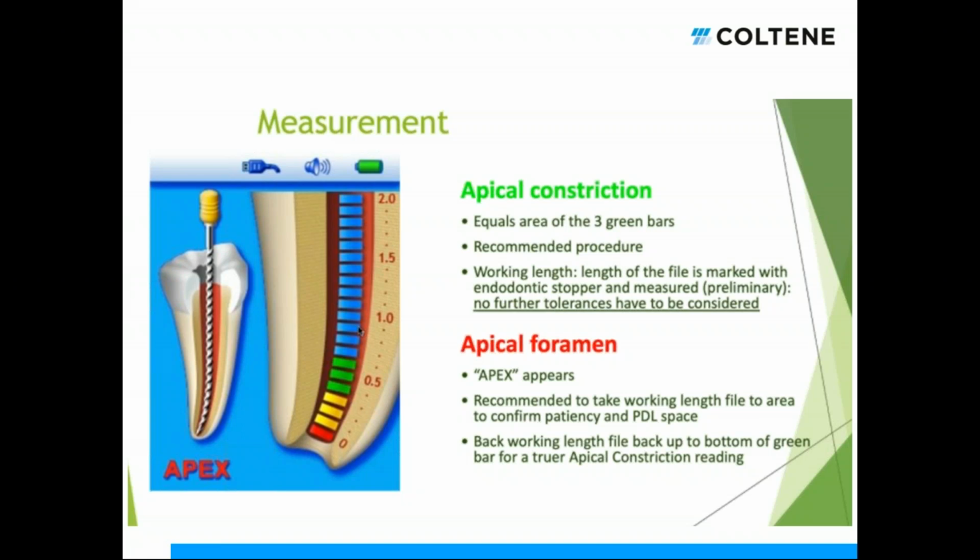Thank you for your honesty, Meredith, and I think I share that same ignorance. And yeah, I'm regretting a lot of what I've said in the past. But does anybody have any questions about any parts of that? And the importance of being able to set that virtual apex on the apex locator. I mean, I think you should do that with every single patient, right? Every canal.